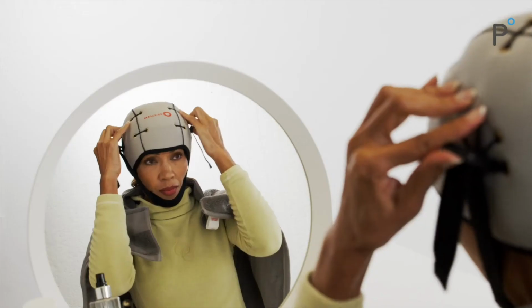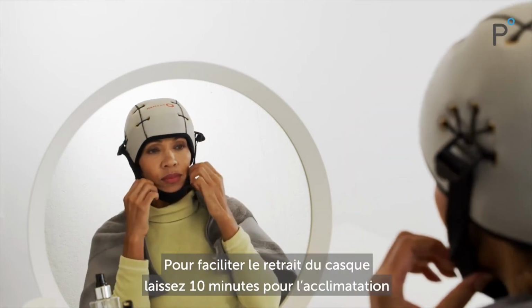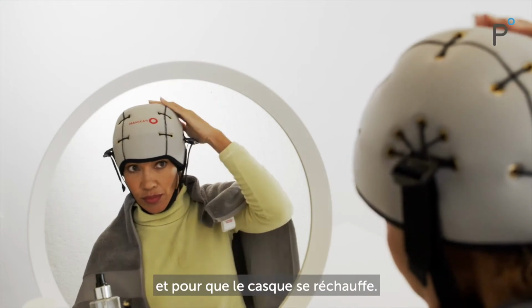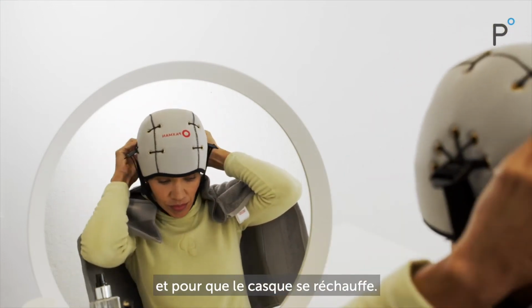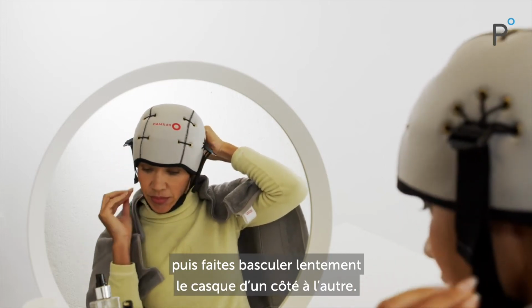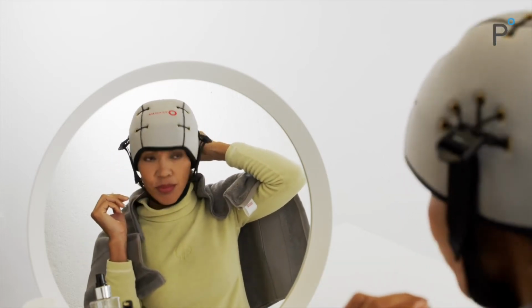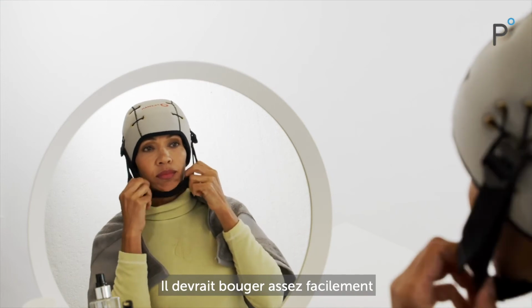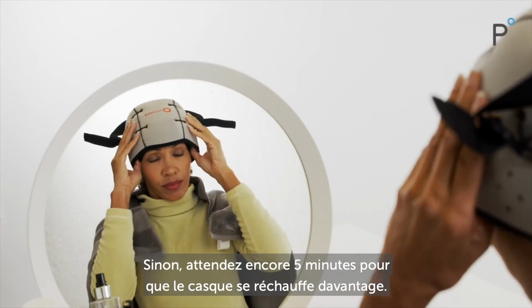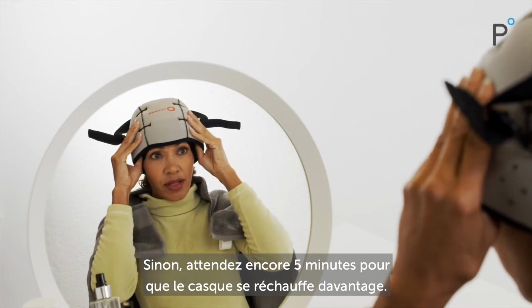For easy removal of the cap, allow 10 minutes to acclimatize and for the inner cap to warm a little. Loosen the chin strap and bungee cords and slowly rock the cap from side to side. It should move relatively easily, in which case you can remove the cap and cover. If it doesn't, wait another 5 minutes to allow the cap to warm up more.